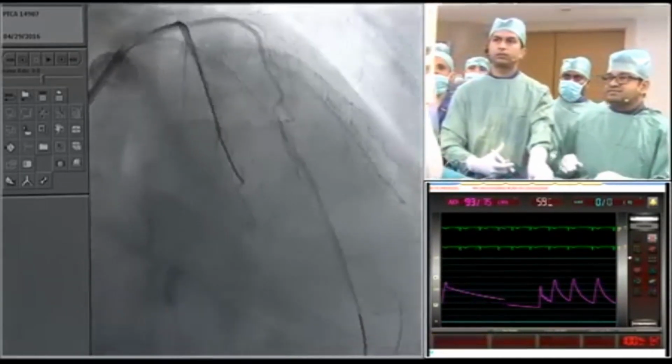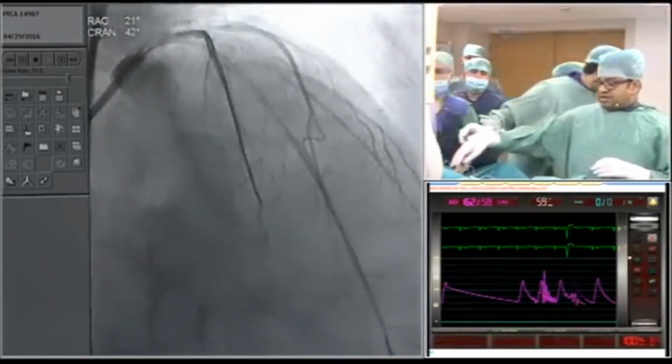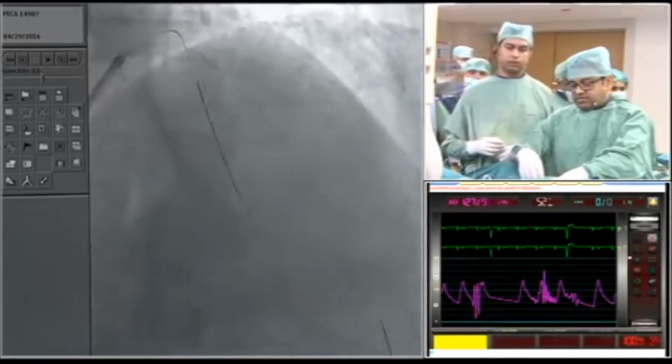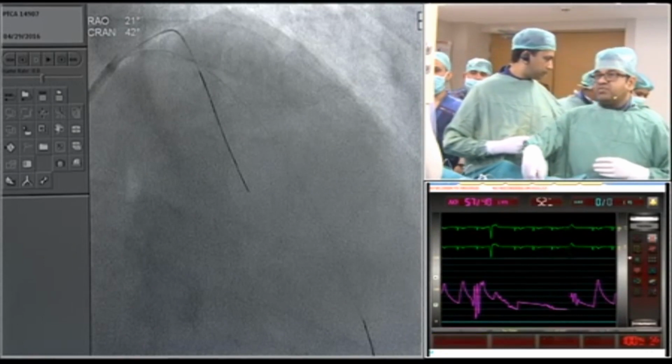But you cannot go up to... you can go up to 4. So it looks like a 4.0, so I think we can go up to 4. A drug-eluting metallic stent, and I had some struts that could even be hanging into the 4.5 left main.